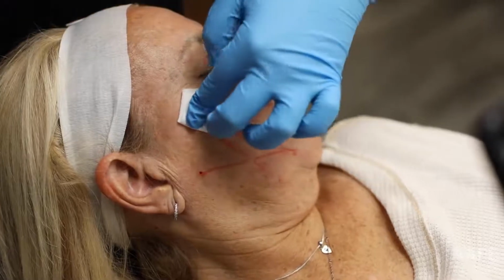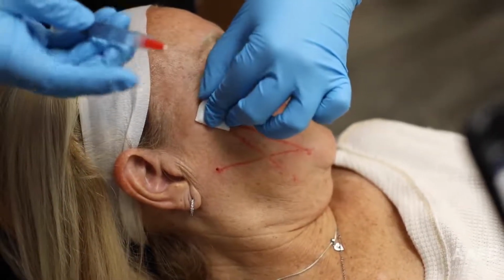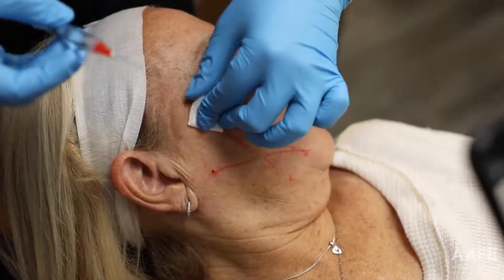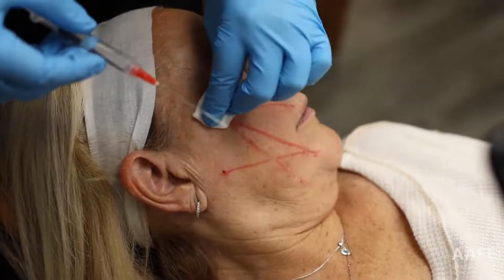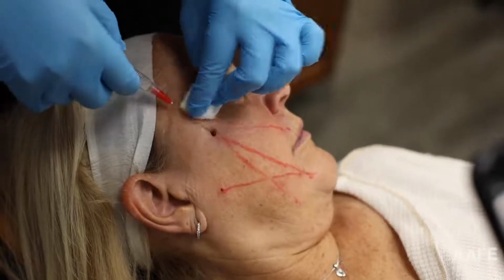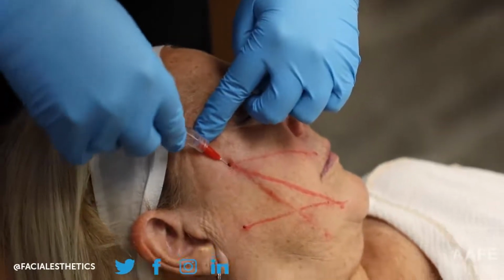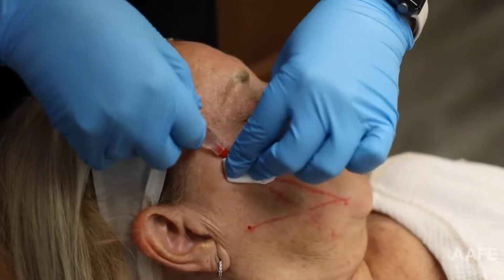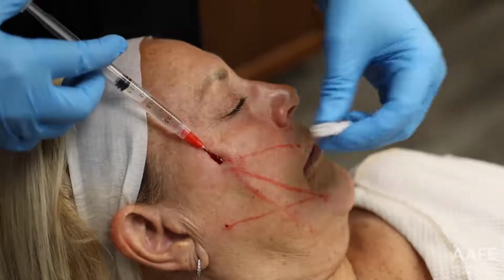Okay, and then I'm gonna go in with, this is a 3cc syringe that's filled with 2% lidocaine, and I have a 25 gauge, 50 millimeter length cannula on the end. So it's blunt tipped, it's not sharp. We're just gonna have that slip right into the tissue, right in that opening that I just made. And we're gonna go down each vector. You can kind of see my depth there, I'm like subdermal. And we're gonna give her lidocaine in each vector, so big burn.